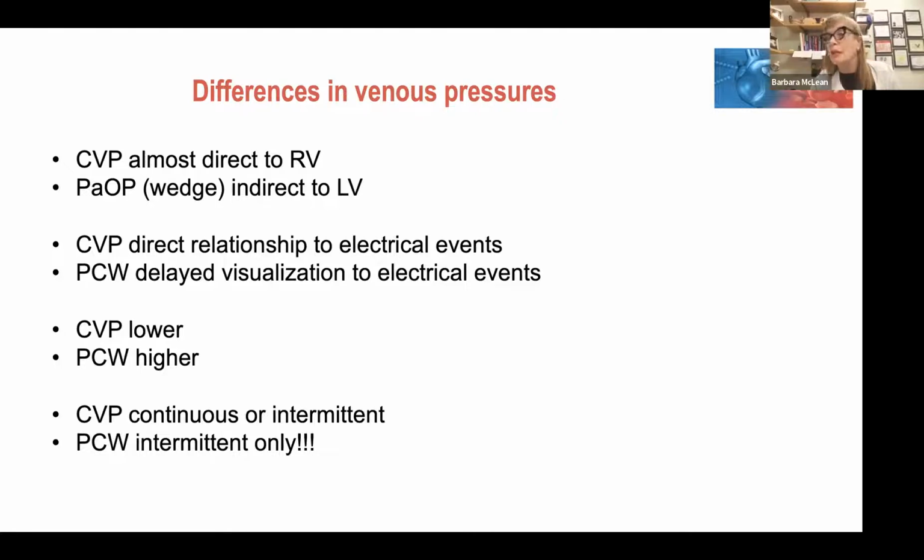If you're interrupting it to give medication, it's no longer continuous, it's intermittent. Wedge pressure is never anything but intermittent. If you are monitoring wedge pressure continuously, your patient is infarcting their pulmonary vascular bed. Do not do that. Do not allow yourself to be writing down a number that reflects that your PA catheter has moved forward and is now in the occlusion position continuously. Your patient is infarcting their pulmonary vasculature.